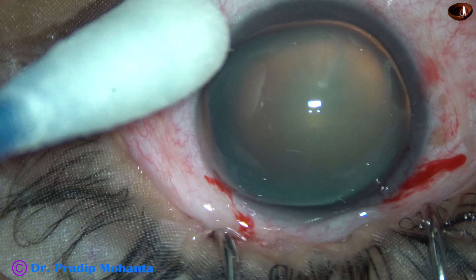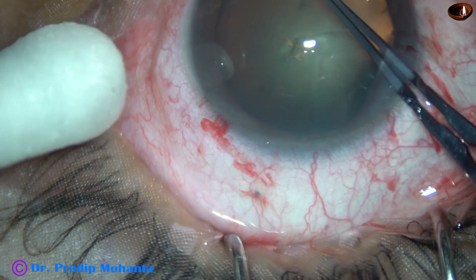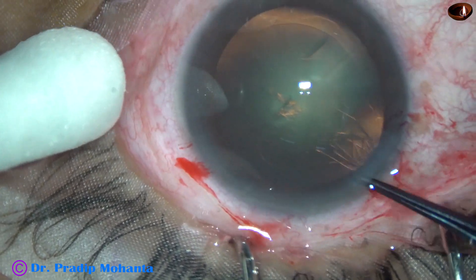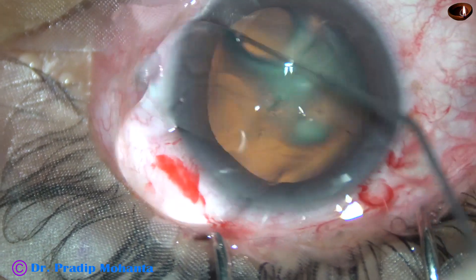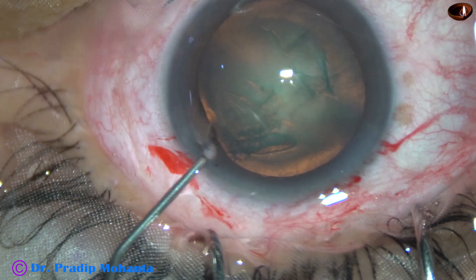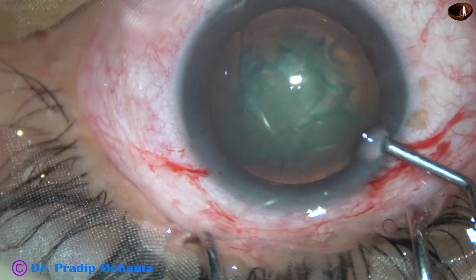Now let us see pre-chop — pre-chop with the help of a pre-chopper. We are starting from capsulorexis, using utrata forceps, which is a very quick way of doing it. Then hydrodissection using a 27 gauge cannula and BSS. The microscope being used is OMS 800 by Topcon, and the recording camera is Sony Alpha 7S2.